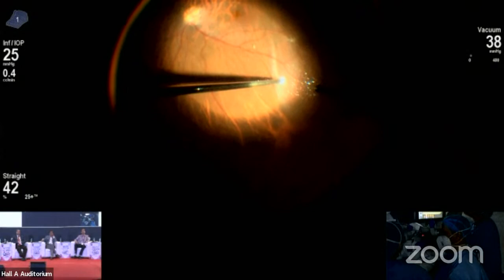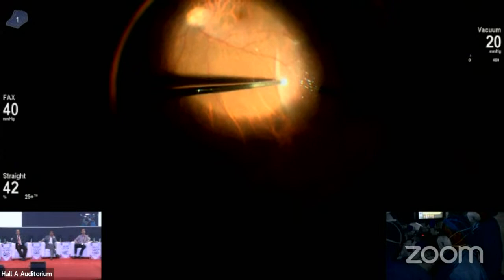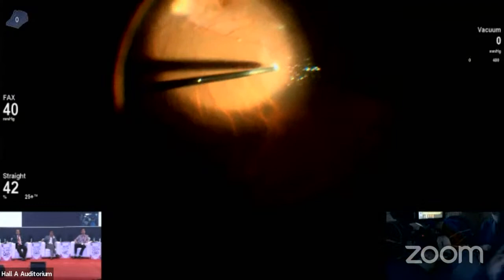Can we go to air, please? So you see, it has already opened up. I have already switched on the air, and you will very shortly see that air coming in the vitreous cavity.